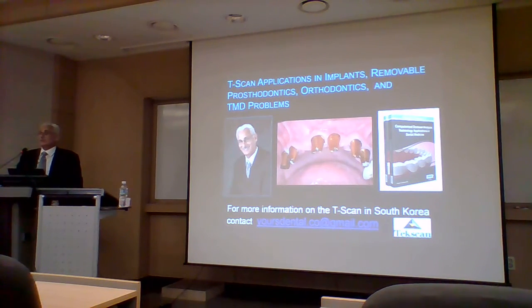Right? So it makes no sense that the T-scan has been resistant, but it makes sense on another level because it's much simpler to use the carbon paper. Think about it, you put it in the mouth, patient bites, we think the data is correct, we look at the marks, we say, okay, that one's forceful. Right? And the patient says, no, Dr. Kirstein, what did you do? That's wrong, that doesn't feel good. Right? That happens all the time.